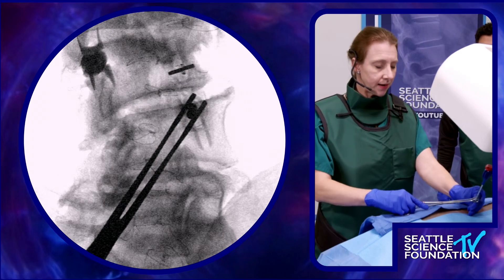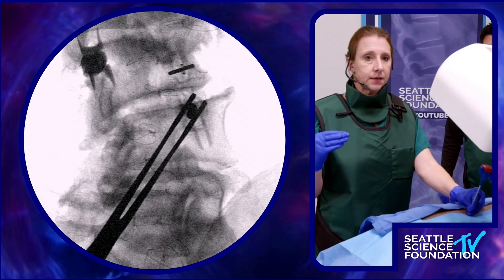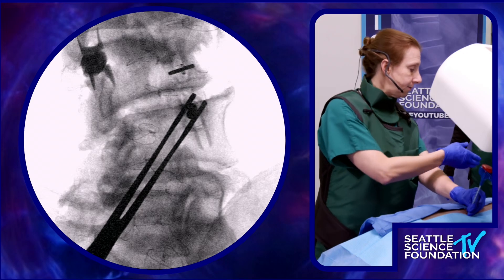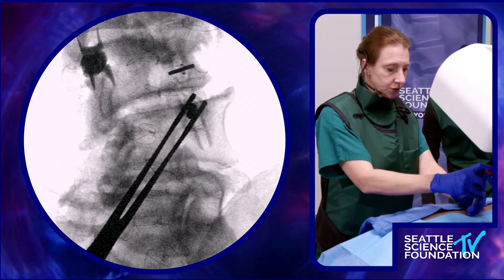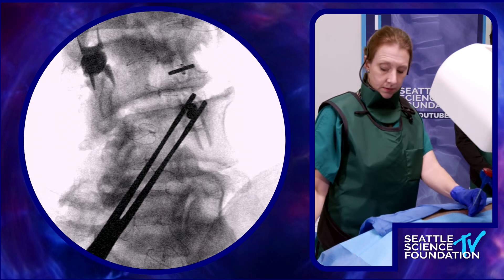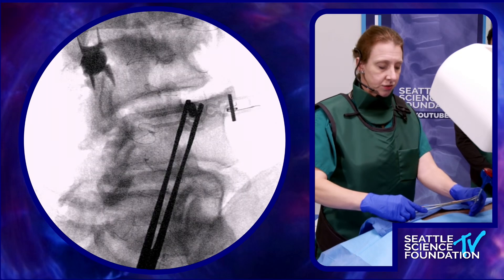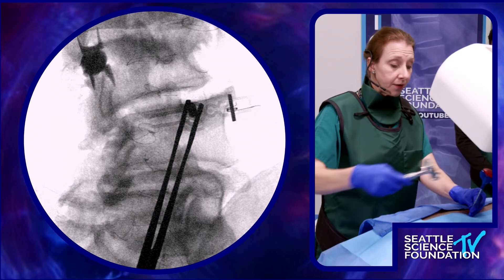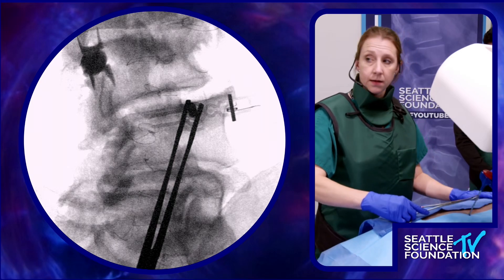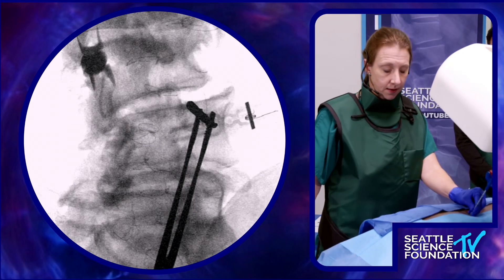The idea here is to dock my introducer cannula right on that most superior and lateral aspect of the on-face view of the pedicle. The idea is to start laterally so that as you advance through the pedicle, you are not entering the vertebral body too laterally or anteriorly. Instead, you want to be entering into the back of the vertebral body on the most medial portion of the pedicle.